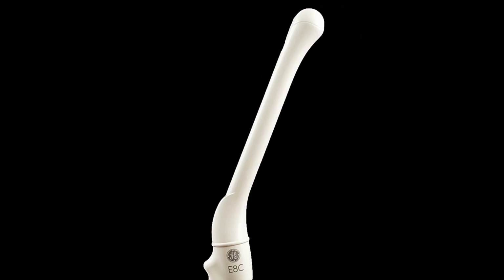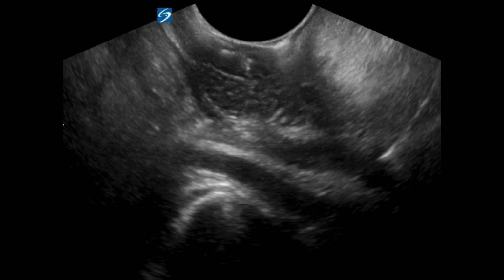All right, so let's talk a little bit about the ultrasound. This is an intraoral ultrasound. You're going to spray some hurricane spray in the back of the patient's mouth. Be careful not to overspray or else you'll give them methemoglobinemia, and that's kind of poor form because then you have to call Dr. Metters and say, oh God, what do I do?